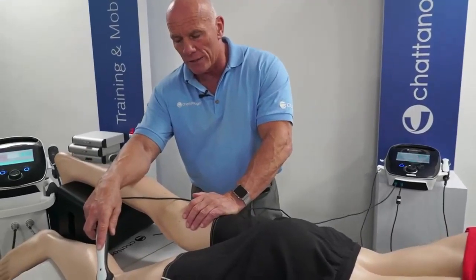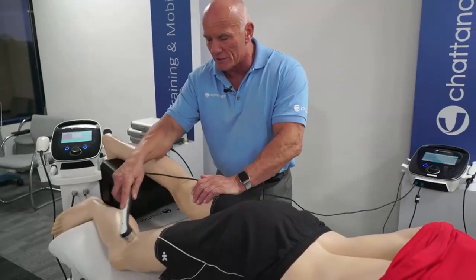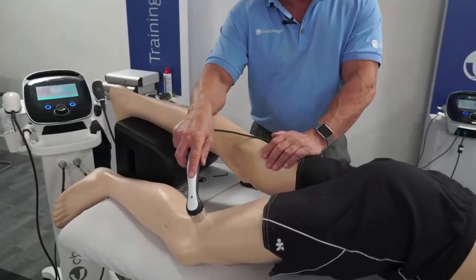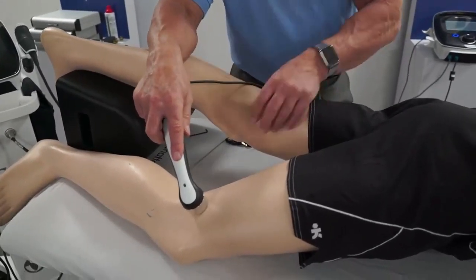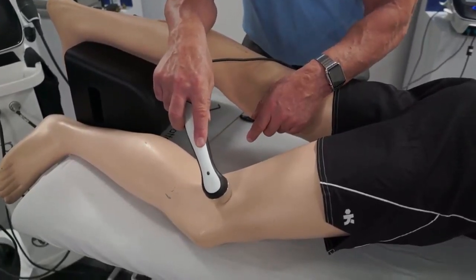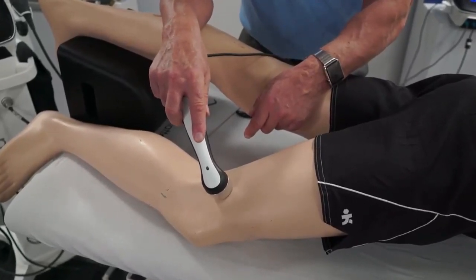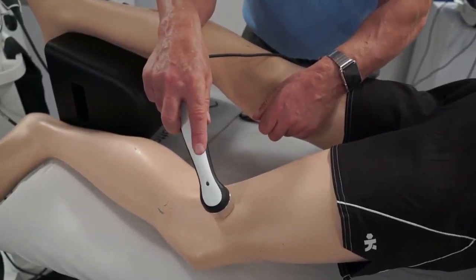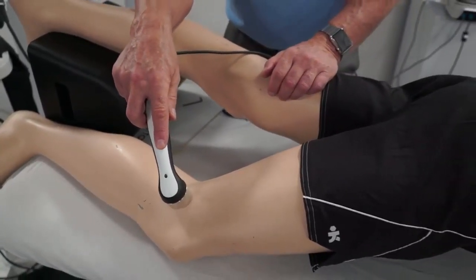That's not playing noughts and crosses because we're bored, drawing pictures, wandering it all around like this, which I see therapists doing. If we have a larger area like the knee, you'll start here, administer your amount of time of treatment, then move on to the next area and work in a small area, and then move on to the next area and the next area.